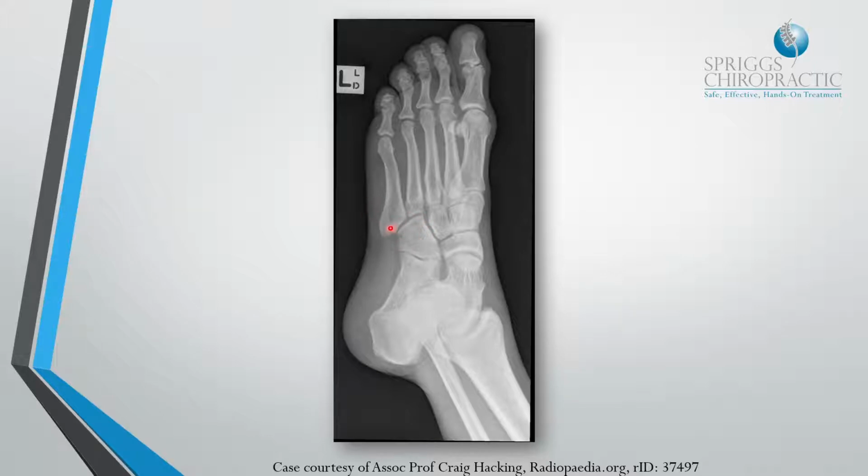Like I said, the only difficulty with this is usually if the patient has significant trauma, and so they have quite a lot of pain and swelling, so it can be difficult for the patient to get into this position and stay there as well.